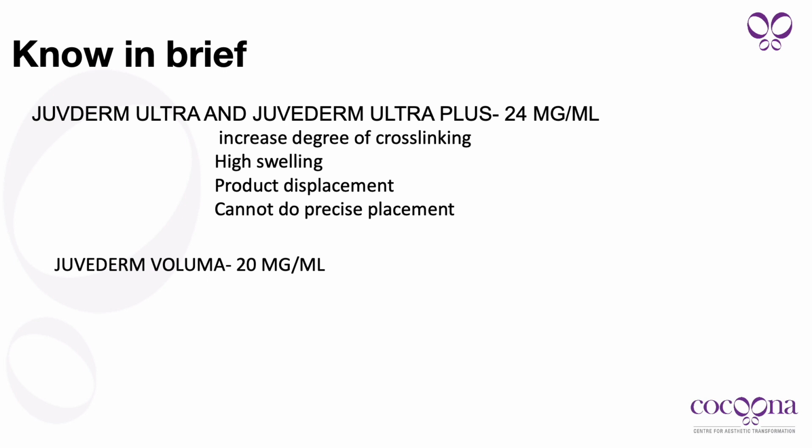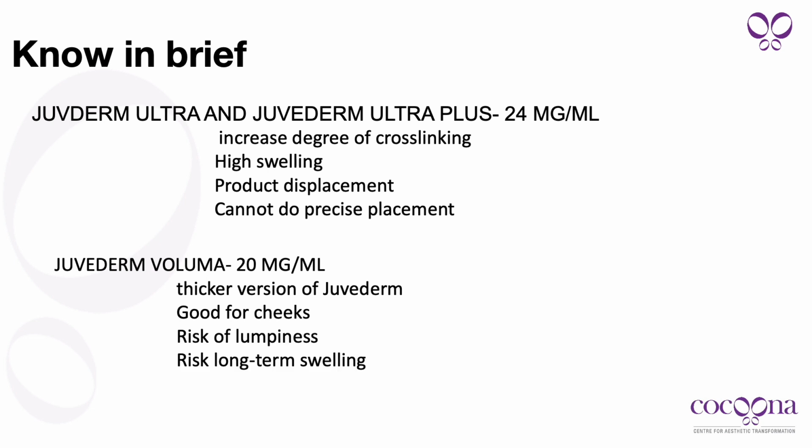Juvederm Voluma is a good alternative with less hyaluronic acid, 20 mg per ml, and it's a thicker version of Juvederm. It does last long. It's good for cheek augmentation, jawline augmentation, chin augmentation. It does have risk of lumpiness. I haven't come across a lot of lumpiness problems.